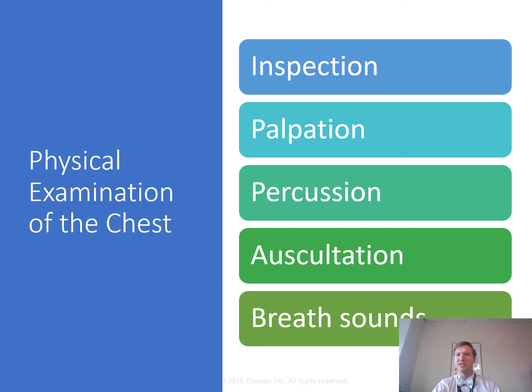Absence of breath sounds usually indicates a pneumothorax, complete airway obstruction, complete lung collapse, improper placement of the ET tube, like a main stem, or even a pleural effusion that we just talked about. So evaluation of both the physical and vent findings, like the PIP, increasing PIPs, and the chest x-rays can really confirm the presence of any abnormal findings and point to appropriate treatment.